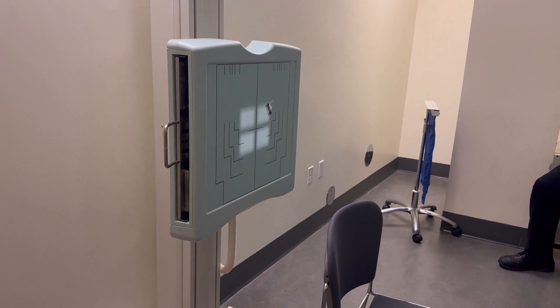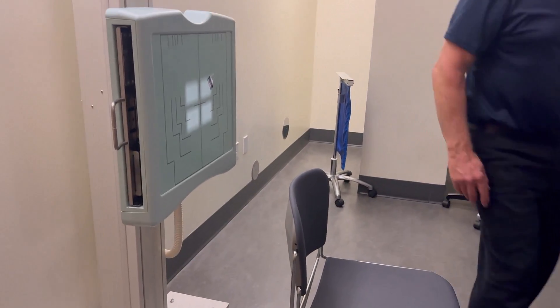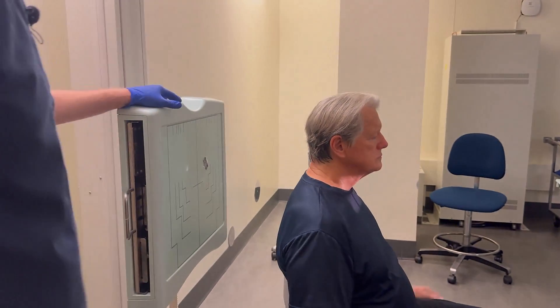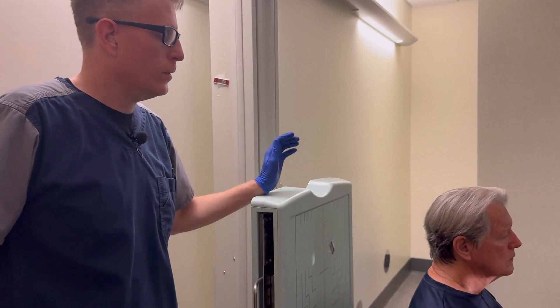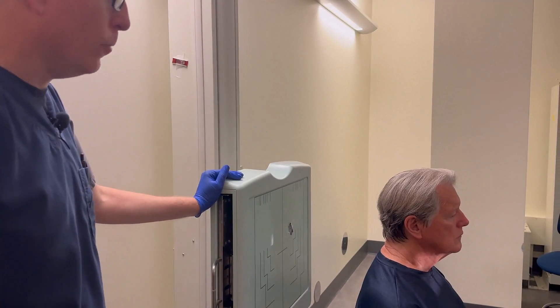Then have your patient come back over and have a seat in the chair. Same criteria — we want the IOML perpendicular to the floor, so that's going to have the top of the patient's head against the bucky, chin level with the forehead.